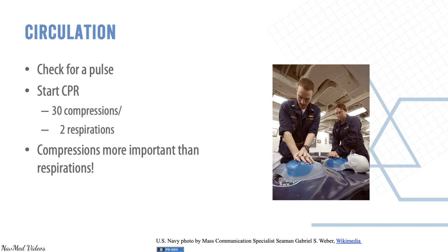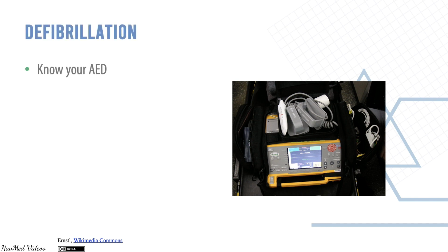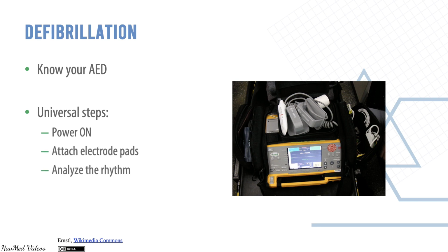Chest compressions are more important than respirations. Defibrillation, know your defibrillation. Universal steps: power on, attach the pads, analyze the rhythm, and shock if it is necessary.